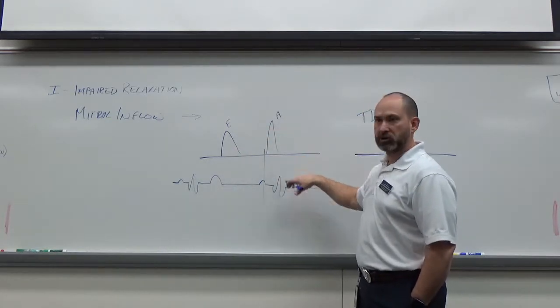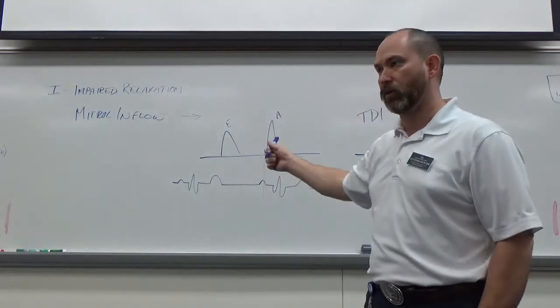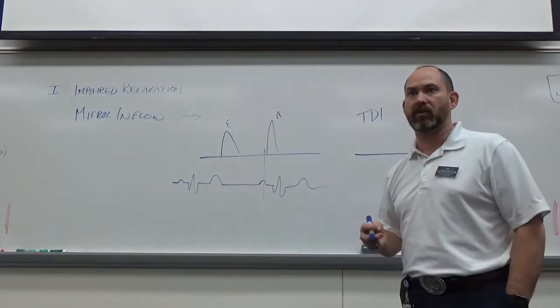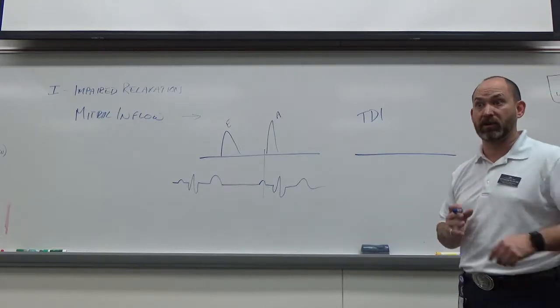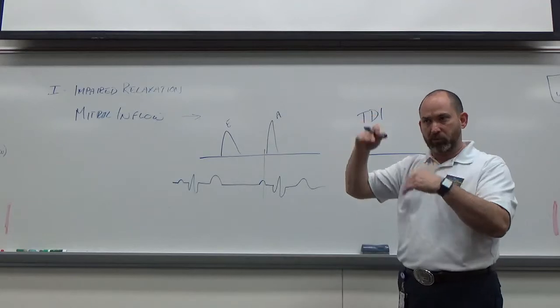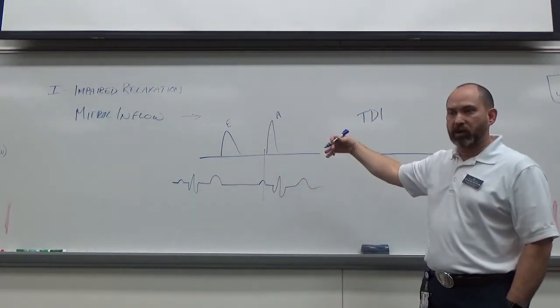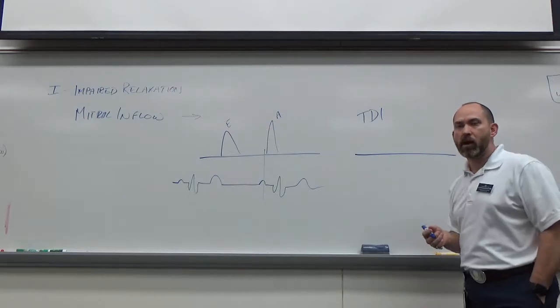If we get into regurgitations, we're going to do separate Dopplers for regurgitations because those velocities for a mitral valve are up around 500 to 600 centimeters per second, so they're significantly faster. So if I'm measuring stuff, I want to measure it at its optimal size. So baseline down, what would my scale be roughly on this?